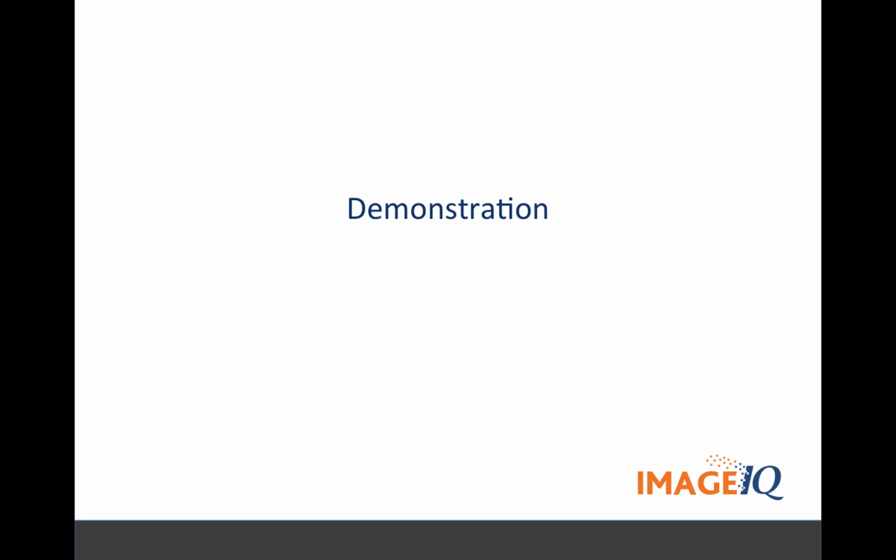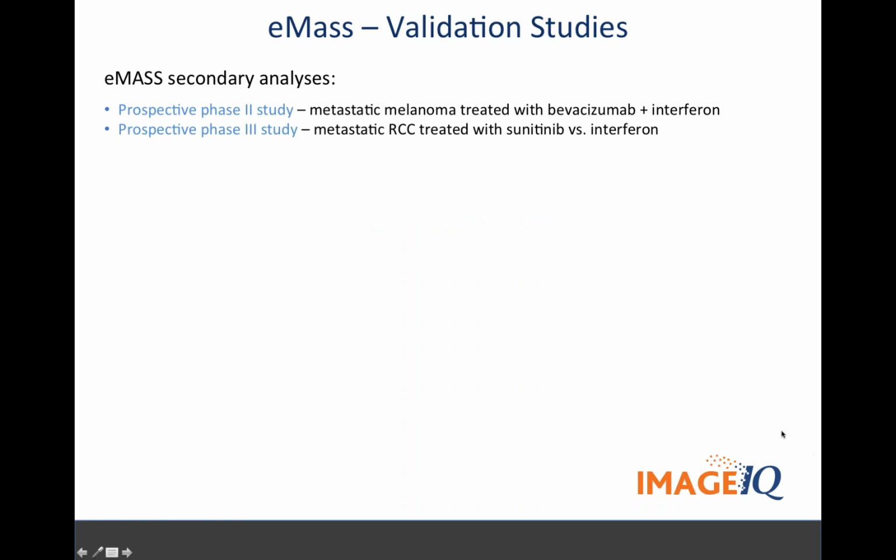Sure, absolutely. Well, thanks for doing the demo. That's great. And we are certainly getting a handful of questions coming in. Just as a reminder, we've got a few more slides to get through, primarily around validation. As any of you touching clinical trials have talked to the folks at the FDA, they always want to know how this has been used and how you have done your validation on your approach. So we're going to talk about that now. If you have any questions, feel free to type them in the question box, and we'll get those answered for you. All right, thanks, Tim.